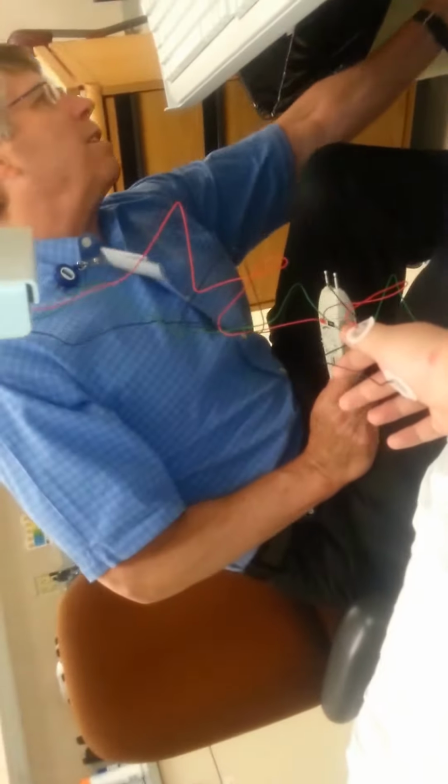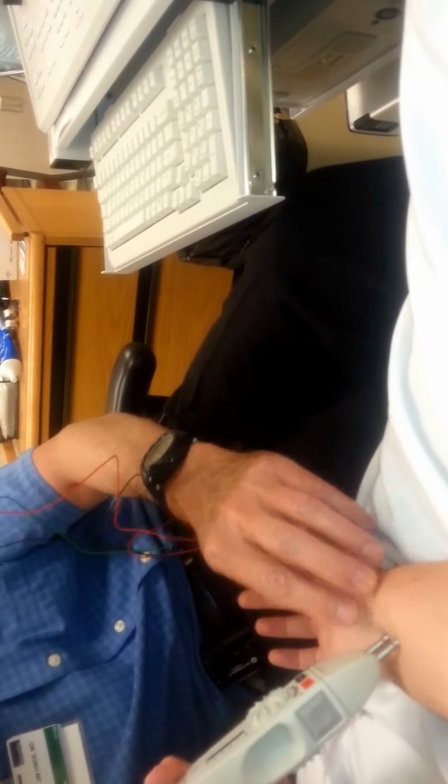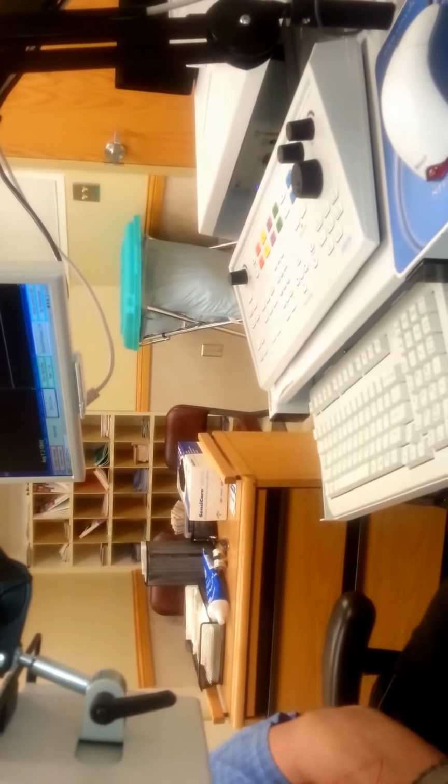And this is the cattle prod. That looks scary. Oh, believe me, it hurts me more than it does you. Won't be bad. I control the size of the shock with that little dial. We start low. And so we're going to look at the screen. I'm going to give you some little shocks and gradually increase them. And when you see a hill pop up on the screen, that's the signal recorded from your thumb muscle here. Okay, so here we go.